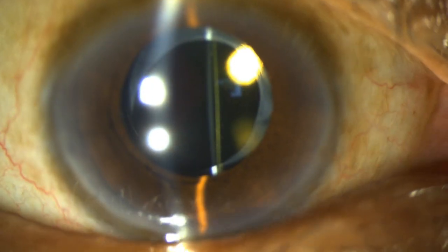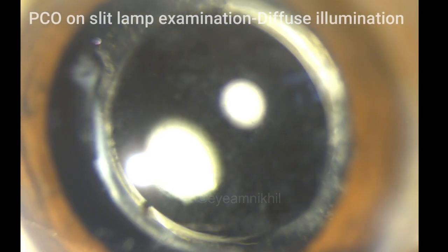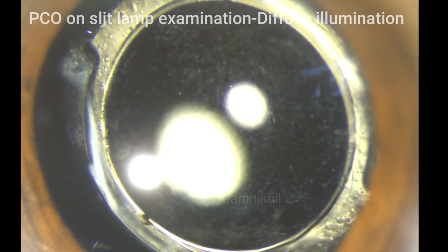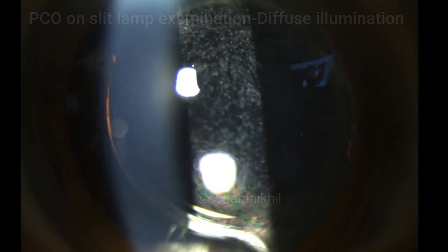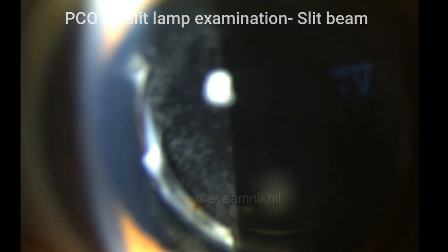This is how a clear lens appears on slit lamp examination, and this is how PCO appears on slit lamp examination. This is in diffuse illumination. You can see the round margin of capsulorhexis. Findings become more prominent on a slit beam. Note how the posterior capsule is opaque.